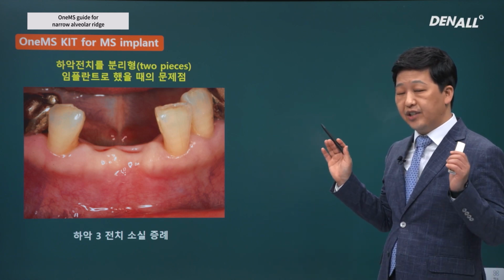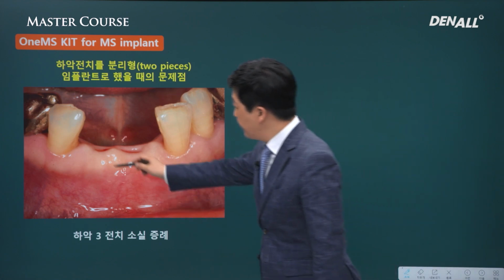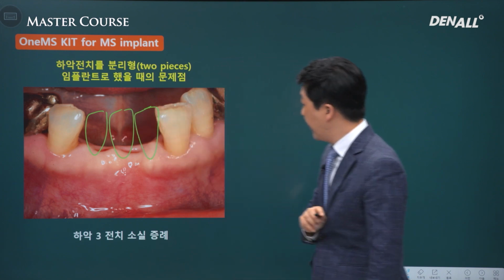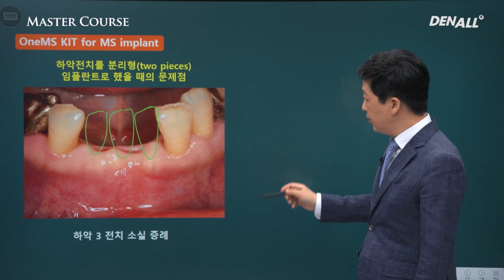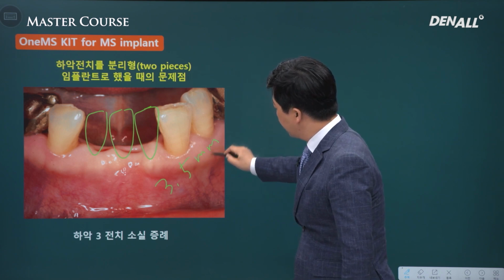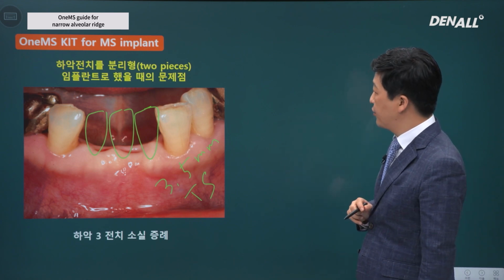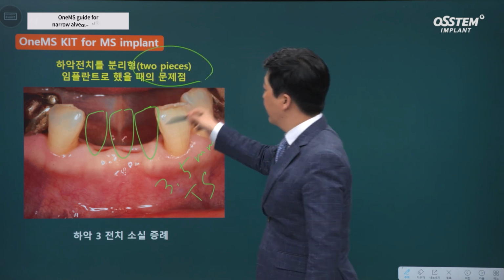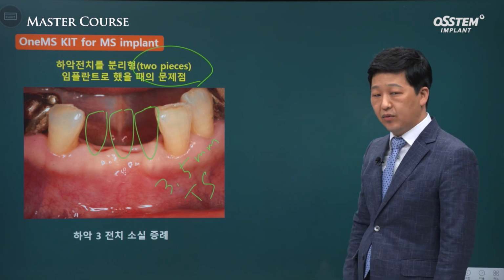This was a case that was performed before the introduction of MS implant. As you can see, 3 anterior teeth in the lower are missing. The best option at the time was a 3.5 diameter TS implant. That was one of the options that could be chosen. This implant is two-piece. What is the problem in restoring lower anterior with two-piece implants?